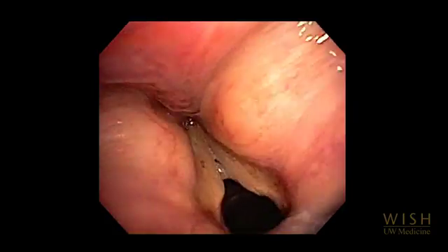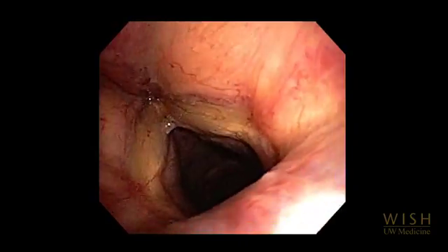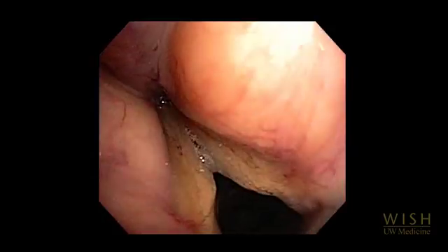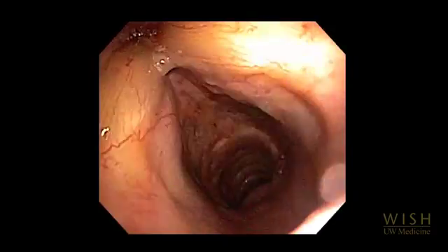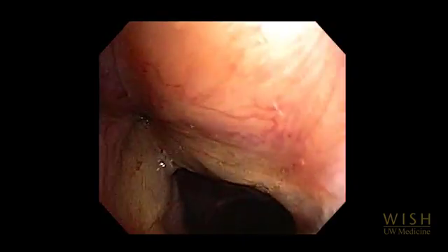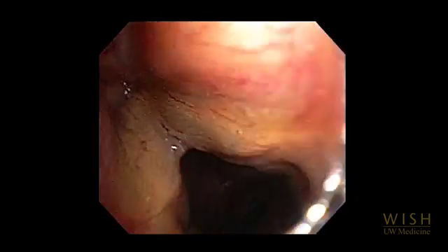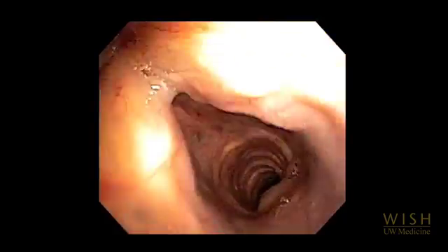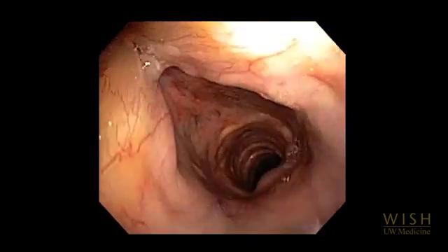Initial entry of the trachea often causes significant cough, so most bronchoscopists administer a dose of lidocaine into the trachea once they pass through the vocal cords. If cough is severe, the patient may need more topical anesthesia, more fentanyl, or both. Try to keep the tip of the bronchoscope and therefore the image in the center of the airway at all times to avoid causing trauma.